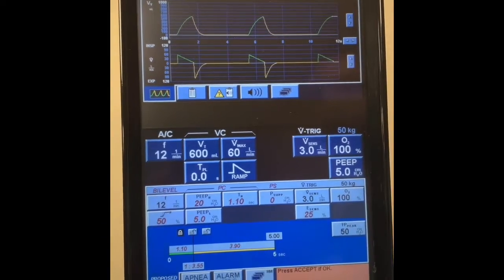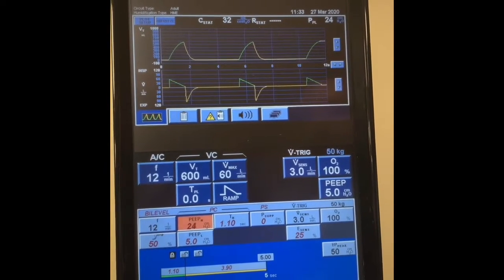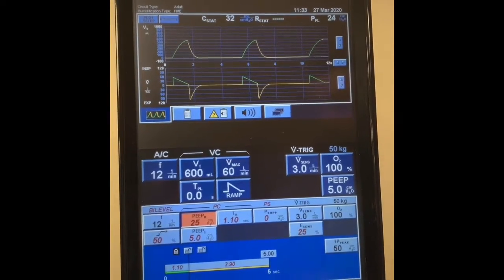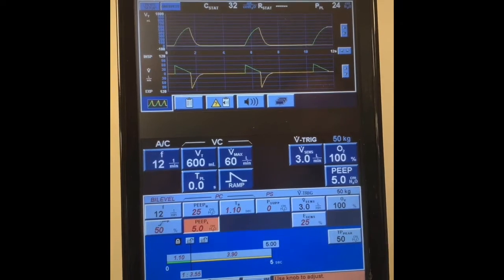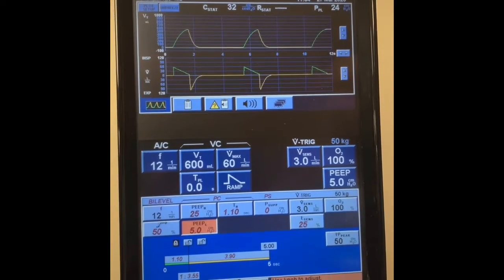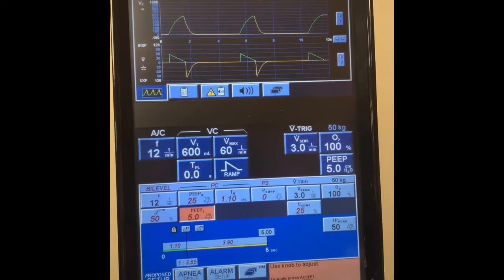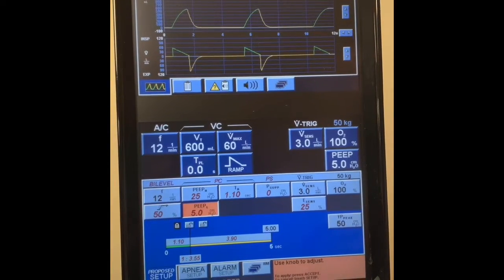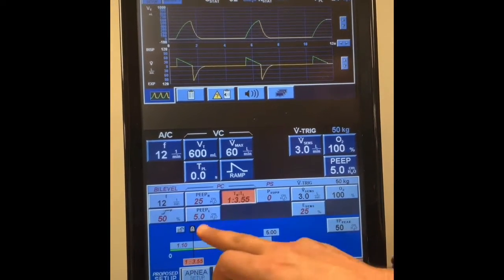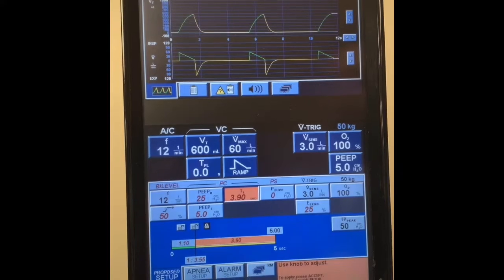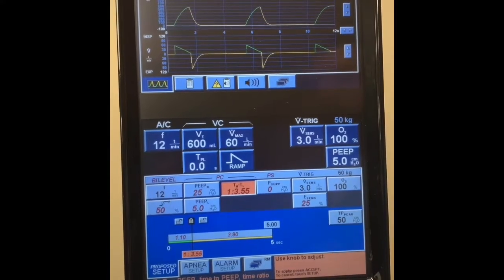Your P high is the next thing to set. Start at your plateau plus or minus 2 — so about 24, we'll go 25 to make it easy. For P low, it's not necessarily required. On bi-level, depending on the IE ratio, I'll keep it at 5. But it's not necessary once you're in APRV, because you're only down in the expiratory phase for a short period of time. Our policy here at St. Joe's says to lock the E time, or time low. My preference is to use IE ratio.